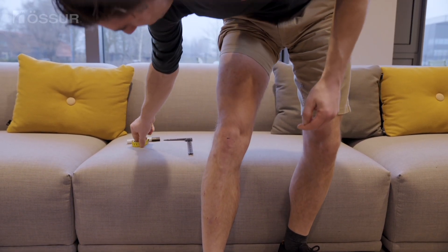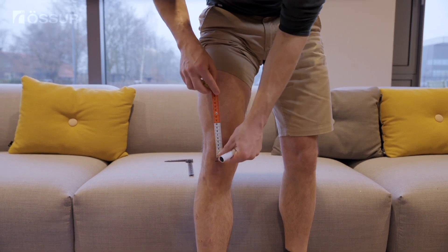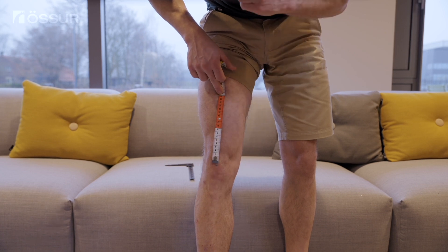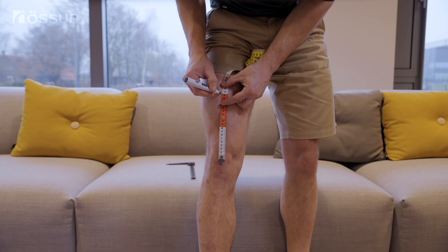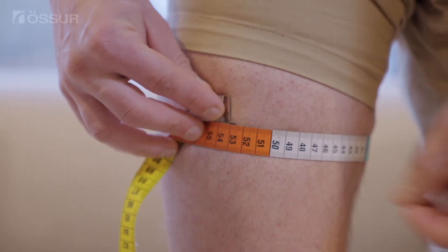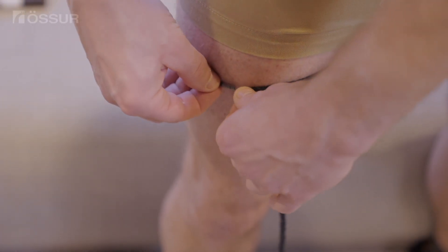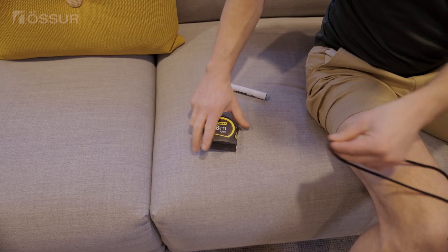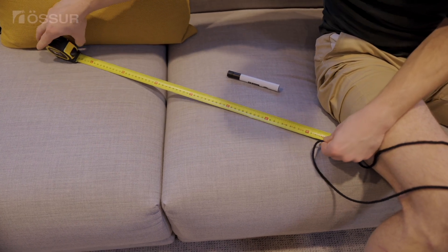If you are on the upper or lower edges of the size range, within 0.2 centimeters or 0.1 inches, fine-tune your size by measuring your thigh circumference 20 centimeters or 8 inches above the center of your knee. Mark your leg and then use a soft measuring tape or a shoestring and a ruler or measuring tape to determine your thigh circumference. Make sure you are in a weight-bearing position without your knee locked out. Use your thigh circumference to determine your correct brace size.